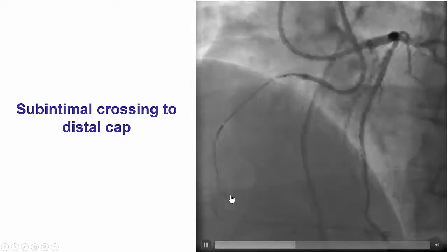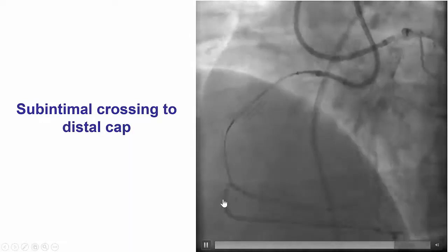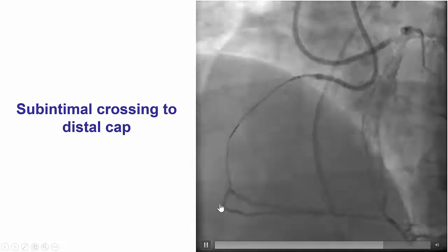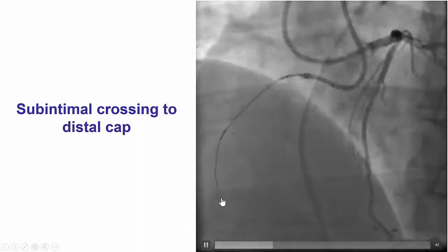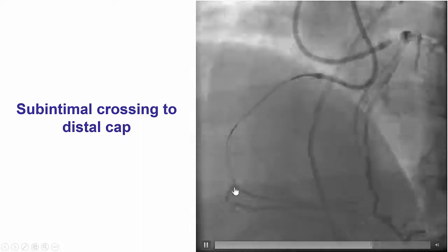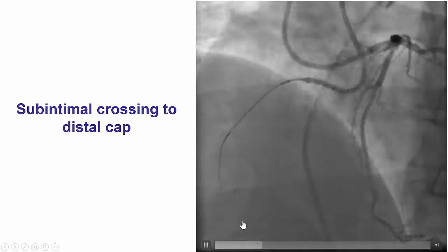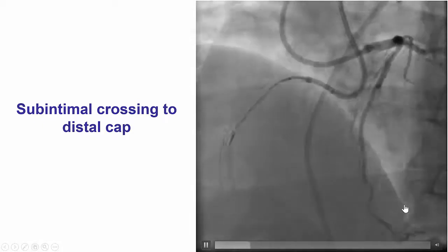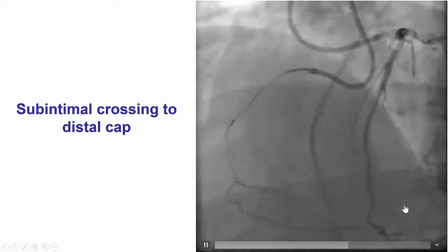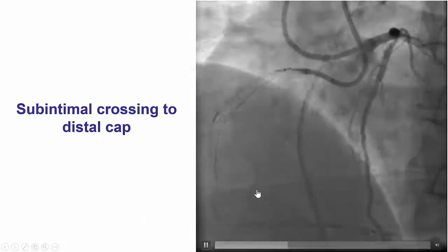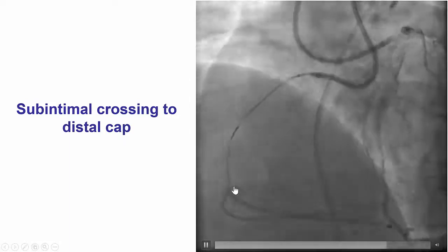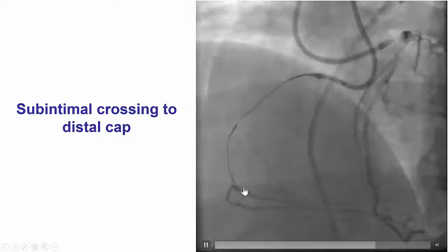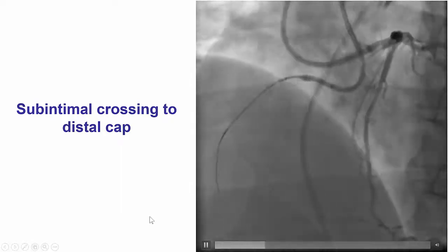The challenge here is that if we re-enter into one of those two branches, the other branch may become occluded. Strategically, the best approach was not to attempt re-entry into the PDA first, because then we would lose flow into the posterolateral — a large branch — and the patient would likely become very ischemic and possibly have a myocardial infarction. Instead, we thought the best way would be to re-enter into the posterolateral first and then re-enter into the PDA.